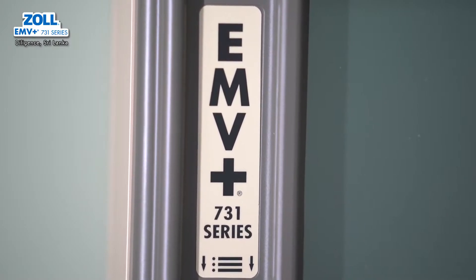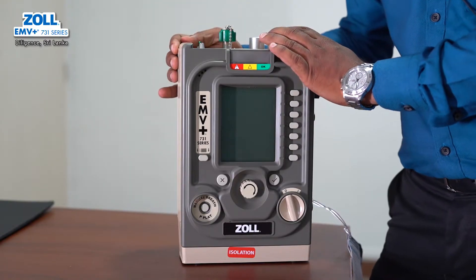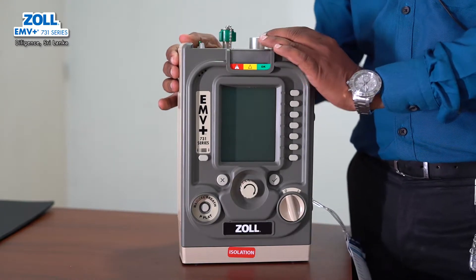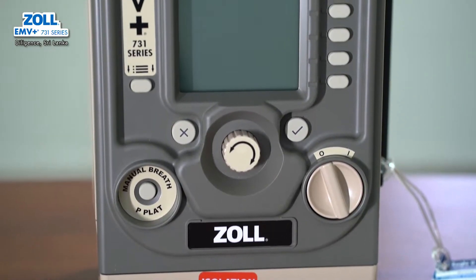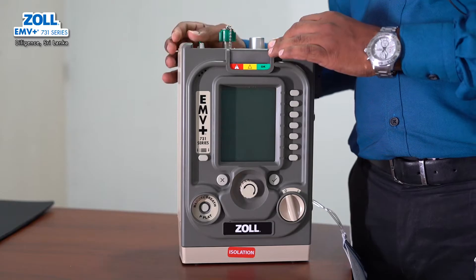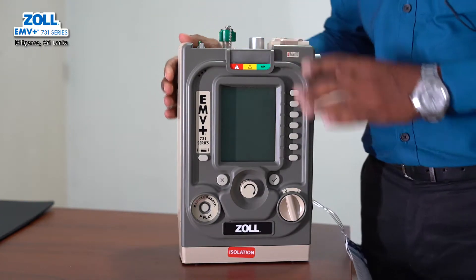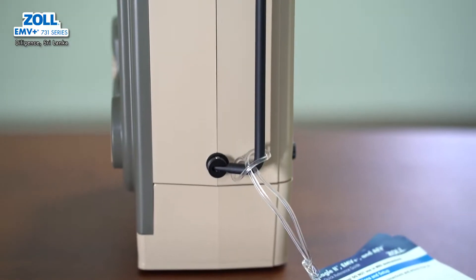It is a heavy-use machine. It has AWR certification. It is a high-tech product with a ventilator. It has passed a 1.2 meter drop test, and it is a product used by the US Army and military users.